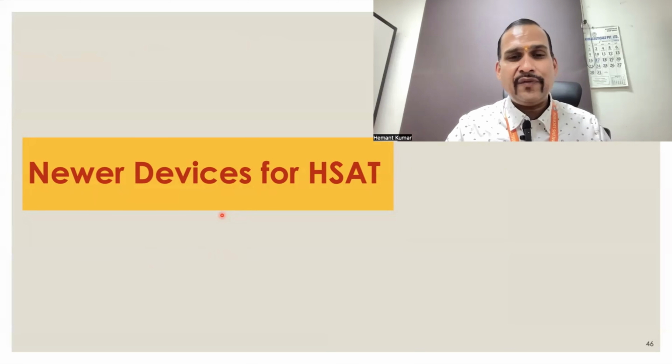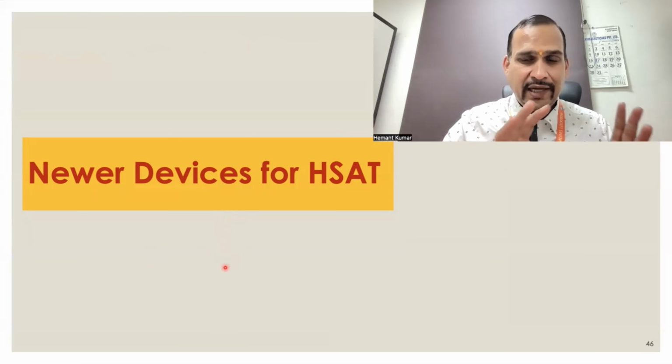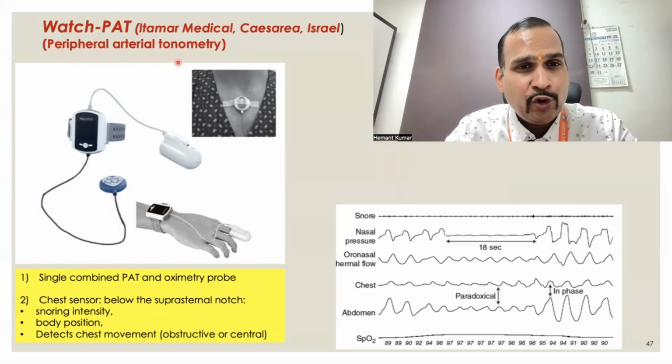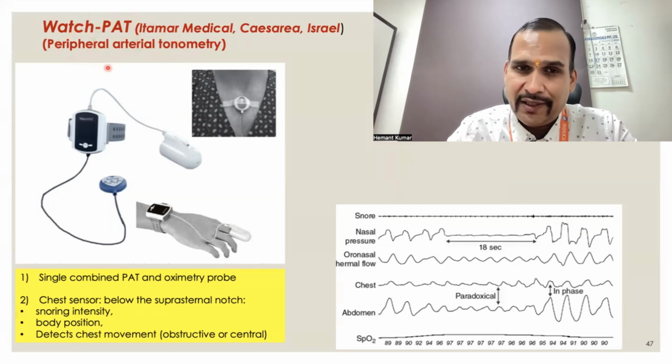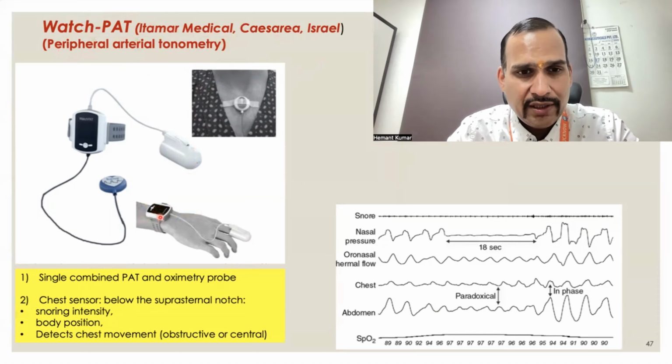Now coming to newer devices for home sleep apnea testing. These are type 3 or type 4 studies. These are newer devices. First is WatchPAT. PAT means peripheral arterial tonometry, the principle by which this machine works. It was developed in Israel by the company Itamar Medical. This is a very small machine, like a watch, and it has a pulse oximeter-like sensor.